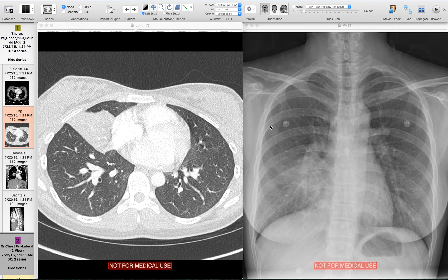I just wanted to show you a couple more examples of the silhouette sign. In basic terms, the silhouette sign means that the reason we can see the contours of structures on radiographs is because those objects are next to an object of a different density. The heart is of water density and the lungs are of air density, so we can see the left heart border because it is right next to the air density of the lung.